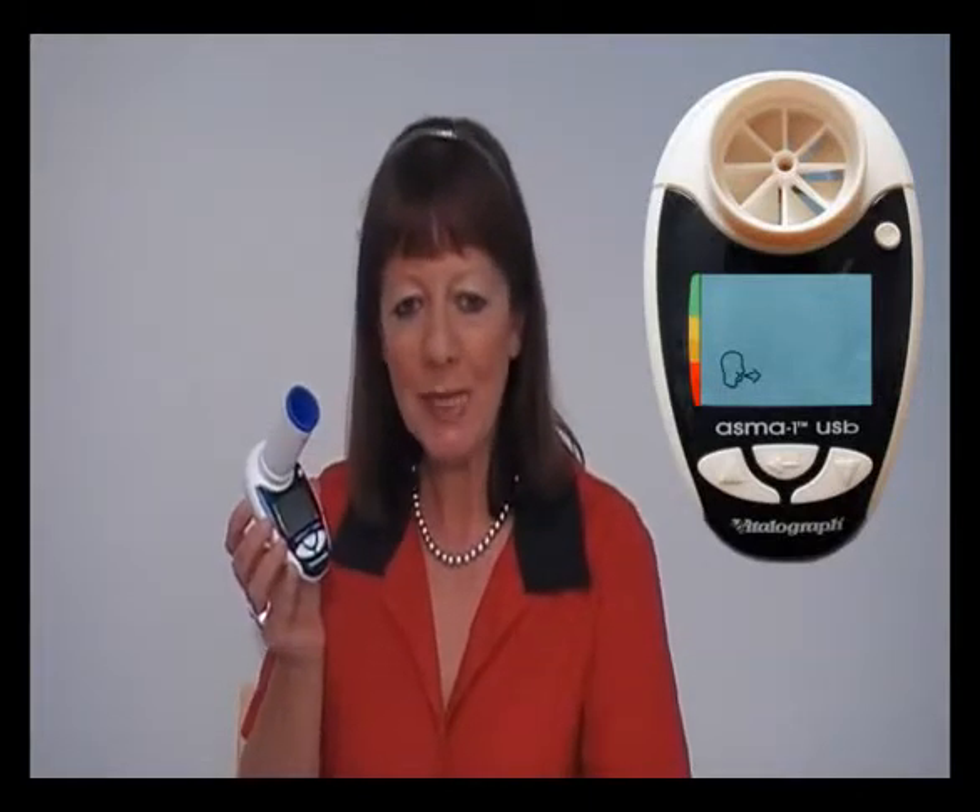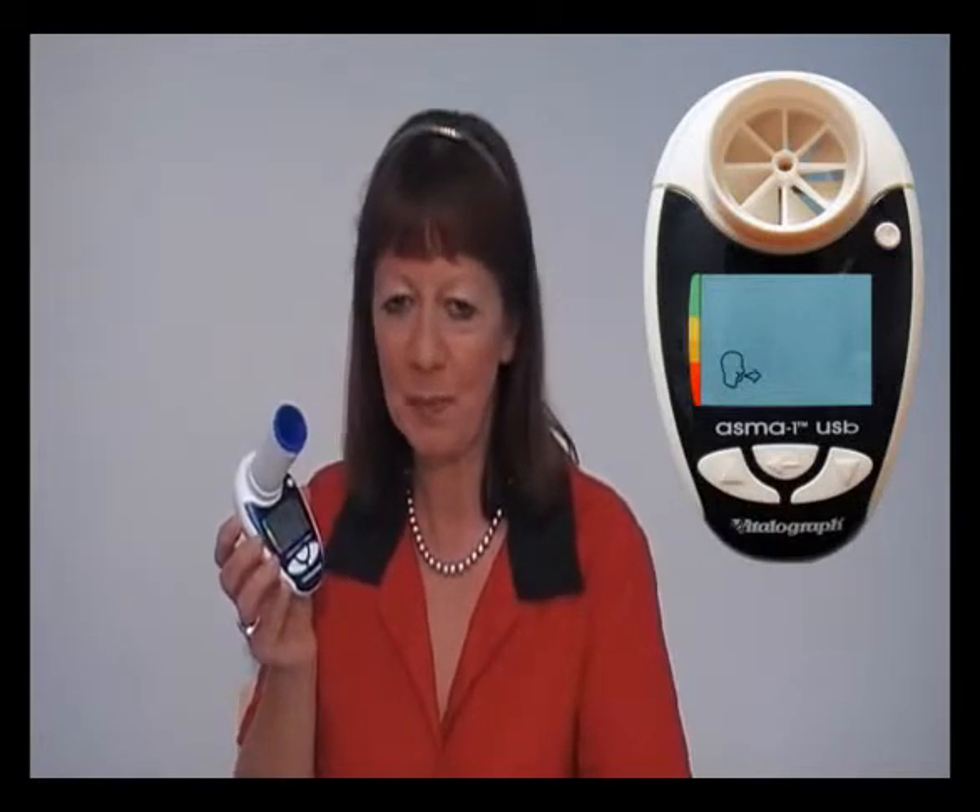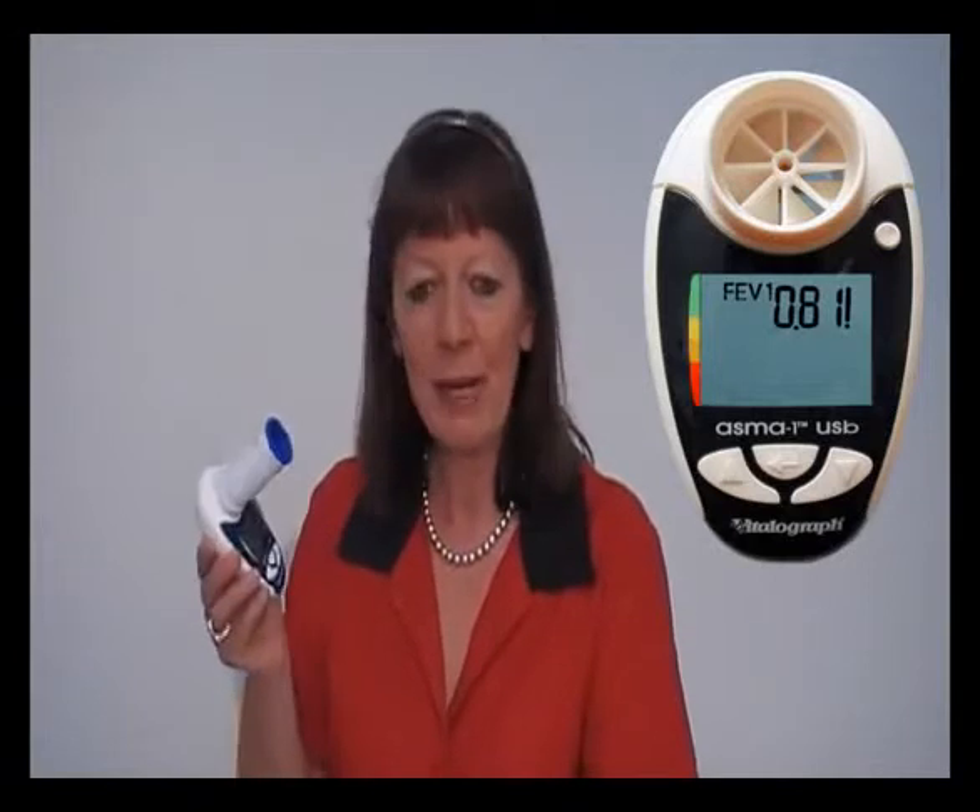A beep will sound to indicate that the device has measured the parameters. An exclamation mark appears on the screen if the blow had a poor start or a cough. Repeat this twice more so that you have performed three good tests.